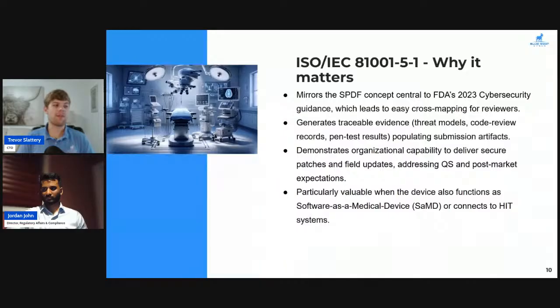Now, I know this is something that comes up all the time during FDA review: how are we handling integration into a healthcare delivery organization? How do we prove that we have these controls? I know that we have some labeling documentation that we like to provide, but in addition to the actual controls themselves built into the product, like encryption and authentication, I'm interested in hearing what are some of the good ways that we can prepare for this interoperability, this integration into healthcare infrastructure.